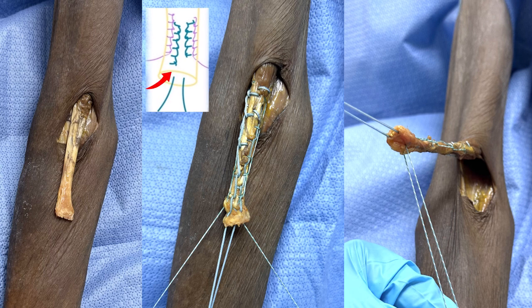On the inner row, the first stitch of the ascending row starts from the tip of the tendon stump, and the last stitch of the descending row is about 1 cm away from the stump. On the outer row, the first stitch and the last stitch are at 1 cm proximal to the tip at the posterior surface.